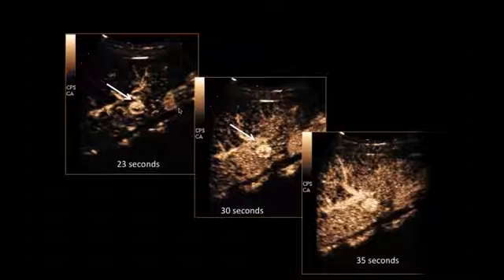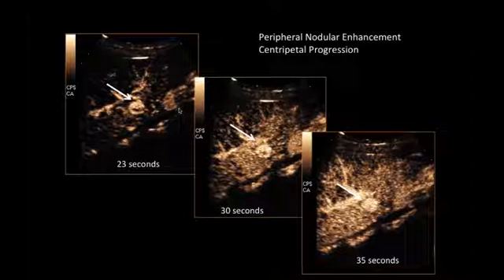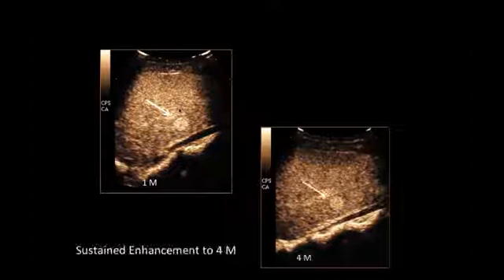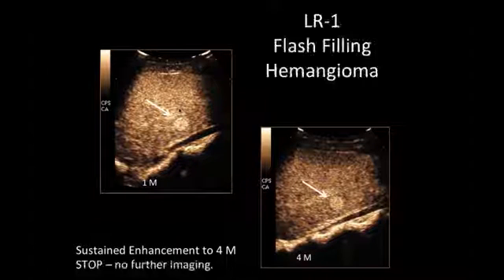Another patient with ethanol cirrhosis, and on a surveillance scan, we can see a fatty liver and a dominant echogenic mass-like region in the liver in segment 8, abutting the vascular structures adjacent. So is this in fact a concerning lesion, or is this focal fat? Well, we cannot determine on the baseline scan, and so we take this large mass lesion and we look at it with contrast-enhanced ultrasound.